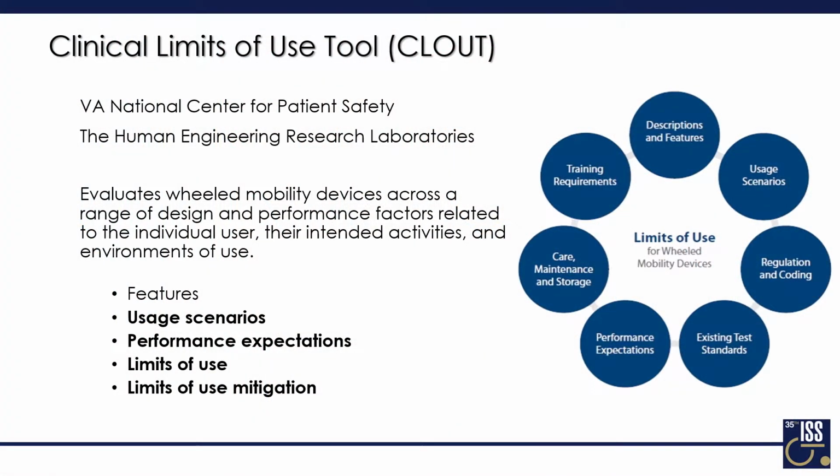But at the same time, we defer to people who actually do have that expertise, because we have to recognize we have limitations there too. The primary reason we need to do that is we're the ones primarily responsible for providing a safe and effective outcome for the device we provide. As we go through, you'll see that there are ways to assess safety for devices, but unless I'm really looking at the person in the device, in their environment, I really don't know if it's safe, and I really don't know if it's effective.